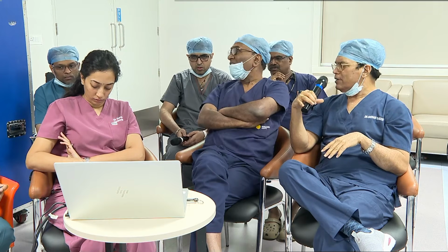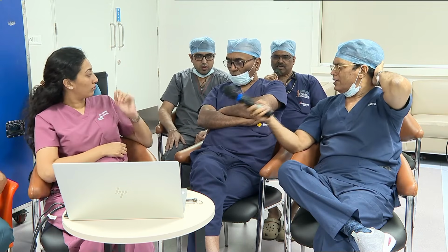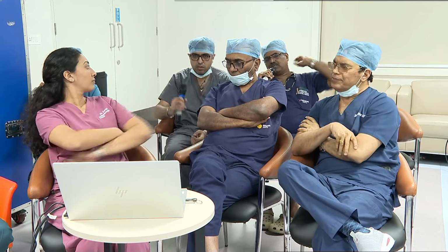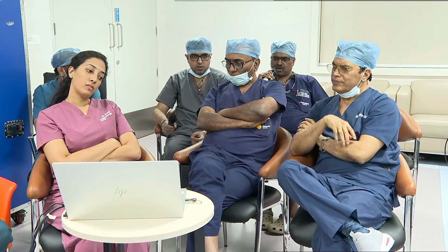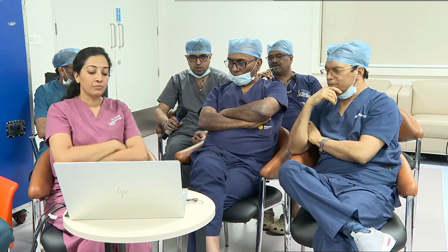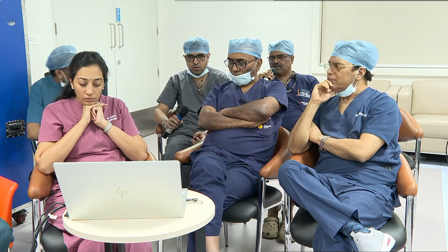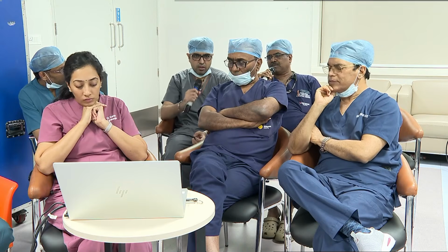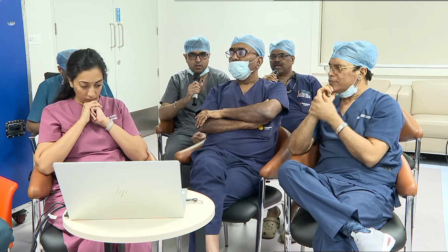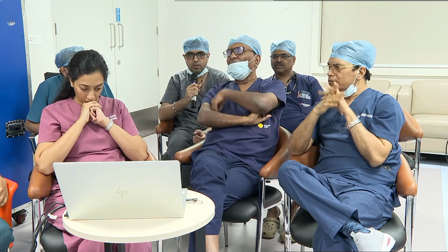Predictors: one is QRS dilatation, sir. If there is any prior QRS dilatation, right bundle branch block or left bundle branch block, or if there is any PR prolongation or a different axis, then you should be careful and be prepared for a permanent pacemaker also. These are the rough predictors. Also, the presence of calcium near the membranous septum. That is an anatomical factor, but that is also one of the clues. Low implantation.